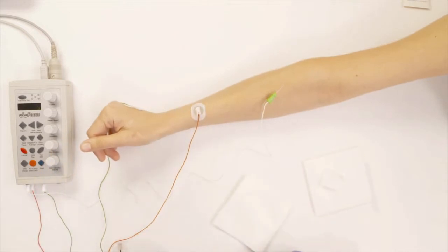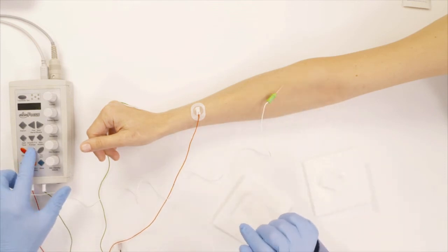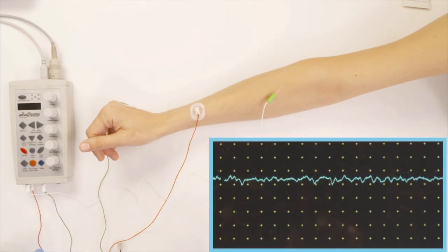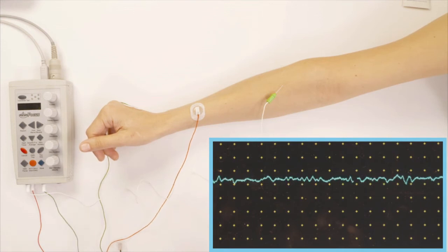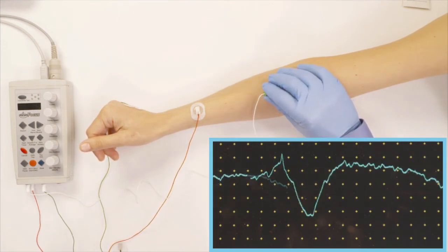So now the next thing I'm going to do, of course, like I did with the other one, is to look at some insertional activity. So I have the needle inside the muscle. I will show this here. And the muscle is quiet right now. That's what it should look like when it's relaxed. And the insertional activity is like so.